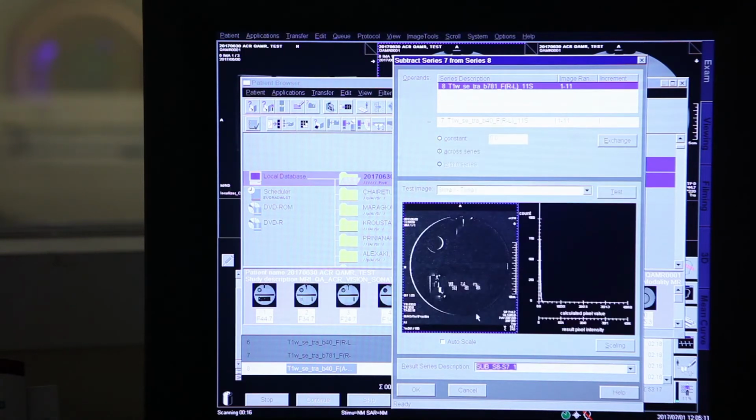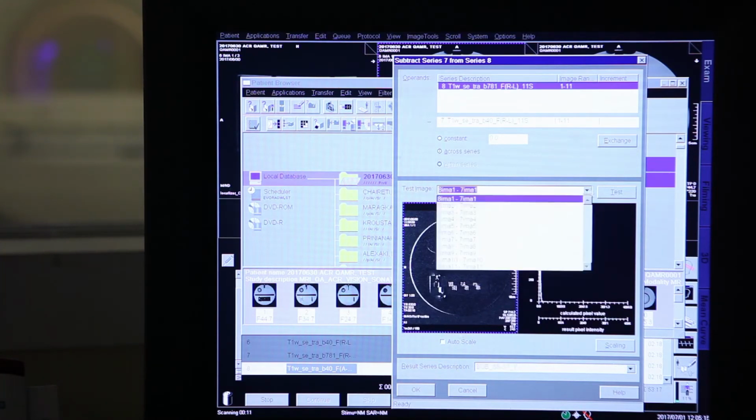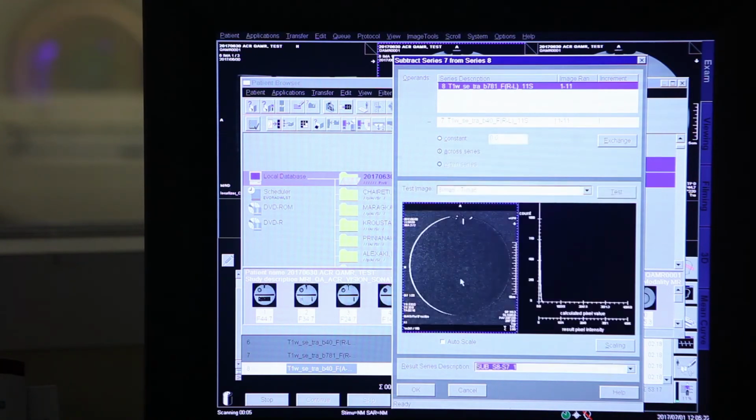You see what's happening here? Yes, I can see the meniscal sign. That's the meniscal sign. You can check the slice as well. That's the important thing of this panel. You can go in number 6, you can test it, and you see what you're expecting to see.